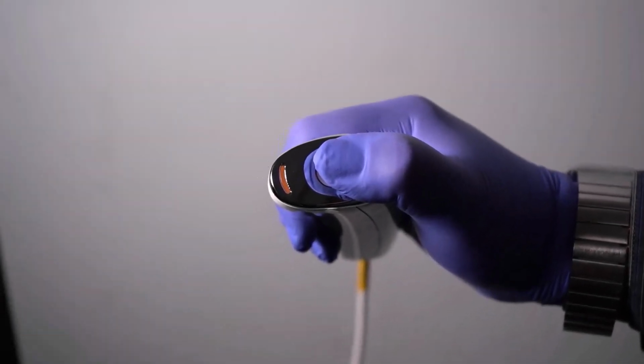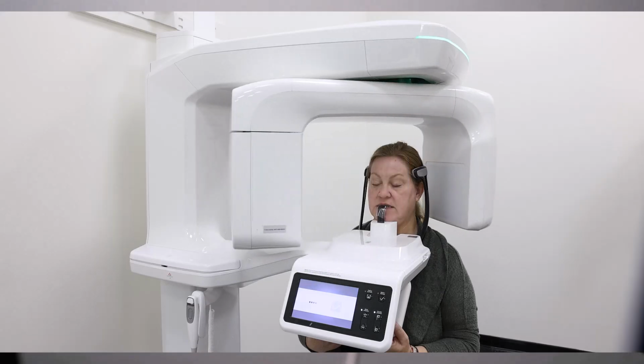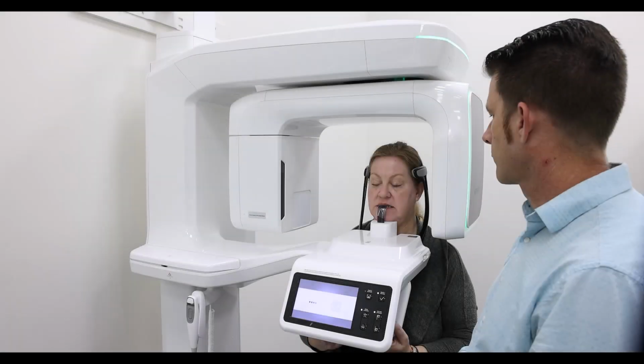Hold the button on the acquisition trigger switch, which will turn yellow when exposing. Hold the button until the image acquisition is fully complete. Image capturing is complete. Please open your eyes and follow the operator's instructions.